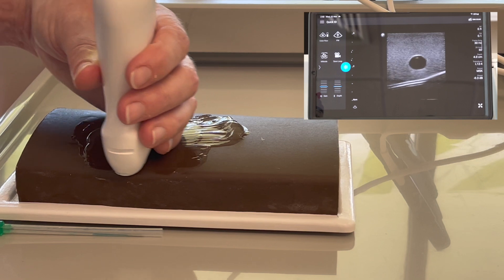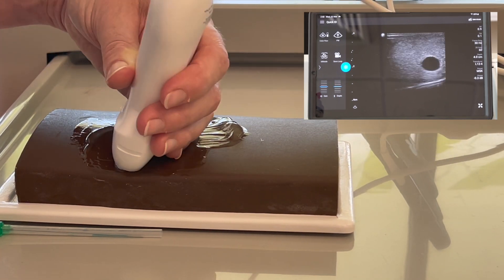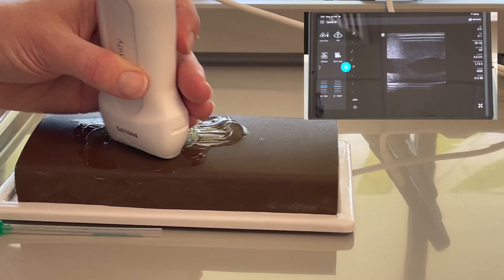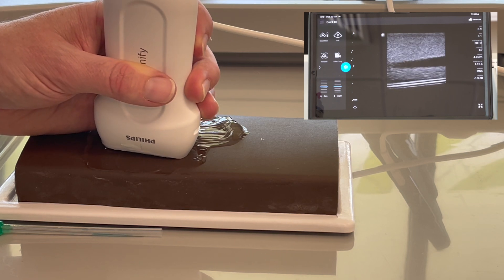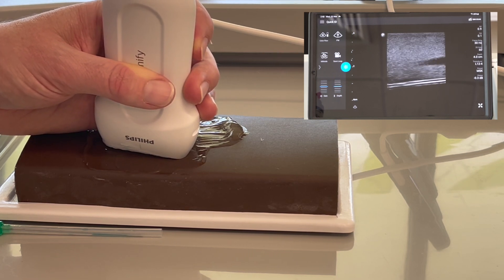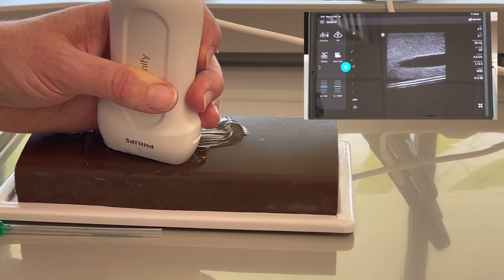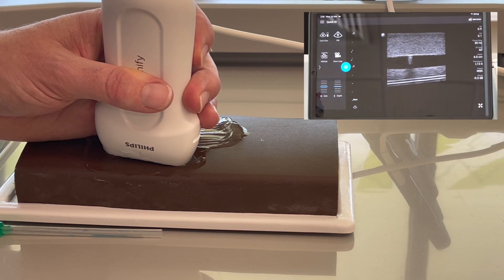This is sliding backward and forward, this is your rocking motion, that's tilting and fanning, and then that's your rotational movement. And you want to see nice defined views of both vessel walls.